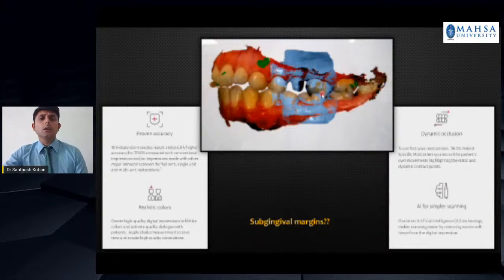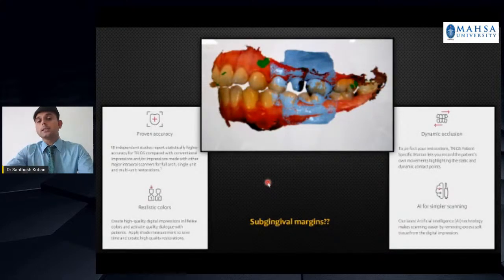So this is a picture of how a digital impression looks, but there are some disadvantages because it is still a growing technology. I'm sure in the coming years they will overcome all these problems. One constant complaint with the digital impression is that you cannot record the subgingival margins properly, because an intraoral scanner scans what it can see, or basically scans what you can see. If you cannot see your subgingival margin, then the scanner also cannot see. So make sure you have done a proper retraction, the margin is visible, and then you can scan it.